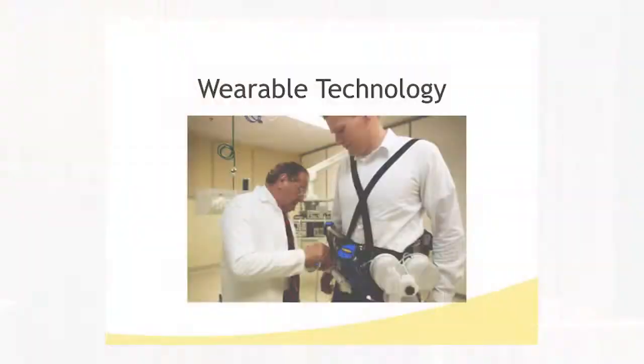As a matter of fact, Jonathan Himmelfarb at the University of Washington in Seattle is just getting ready to pilot a study in patients using wearable technology. And this will be the dialysis. So you're looking at the future of dialysis, I suspect, in some forms. This is a home hemo machine. It weighs about 10 pounds. It's a dialysis machine that you can wear everywhere you go, if you want to dialyze everywhere you go. The kidney is right here. You can see it's right here. It weighs about 10 pounds.